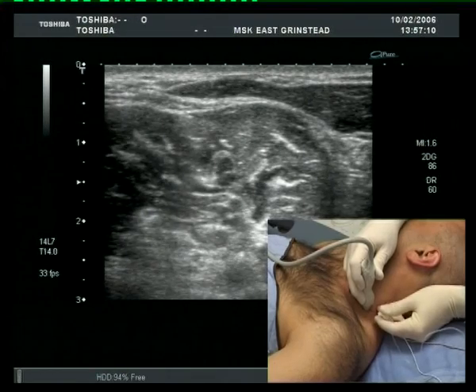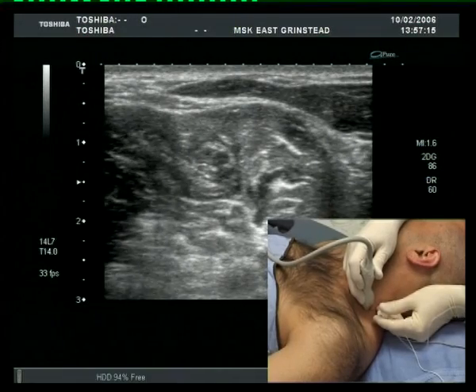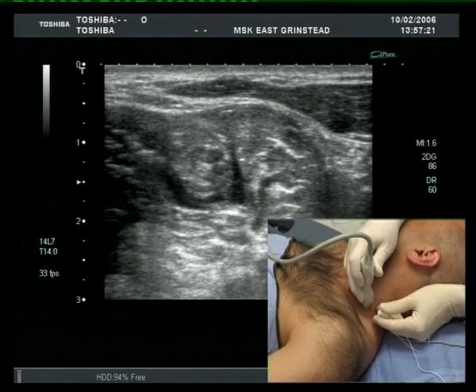Local anesthetic is not always seen to spread evenly around the roots. Rather than inject a large volume, as might be common practice in a landmark technique, here the needle tip is repositioned for further injections.